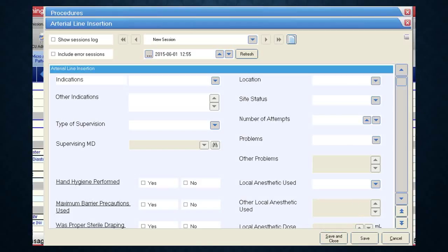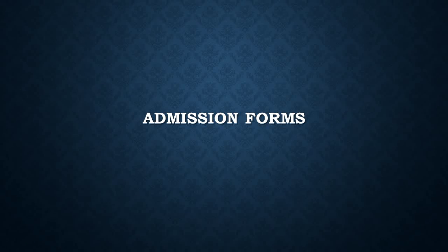The form is there to facilitate documentation, not change your practice. No section is required with the exception of the indication, so you can leave areas blank if not relevant. If you're a quick documenter — for example, you'd normally write 'arterial line inserted, first attempt, no problems' — then reflect that with a few quick clicks, hit Save and Close, and you're all done.